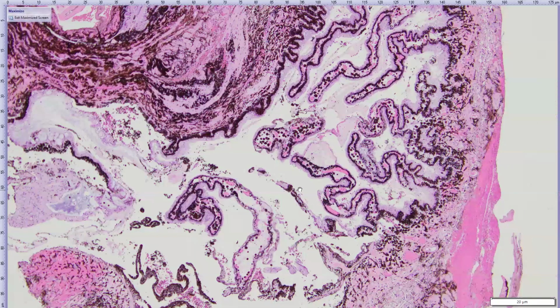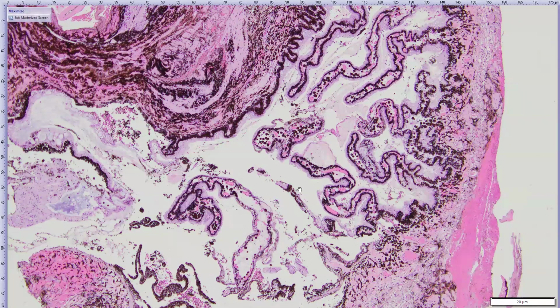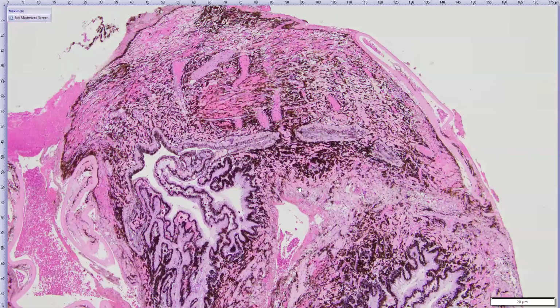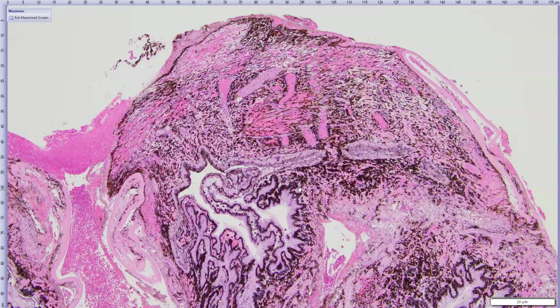The other biggest thing to note here is that there is no neoplasia seen, which is a big question when you do an evisceration sample, because you want to make sure that there's nothing neoplastic that was maybe hiding in the eye and that could potentially be remaining and affecting the scleral shell.